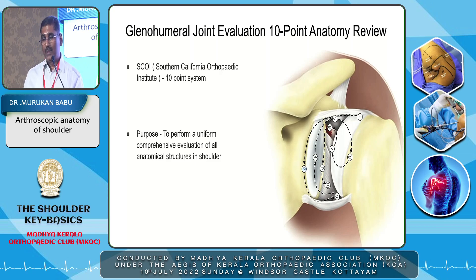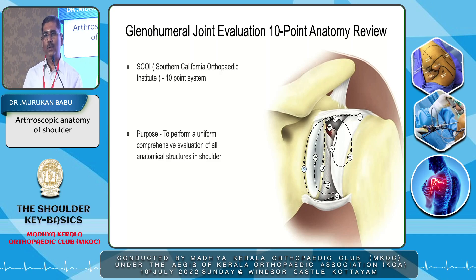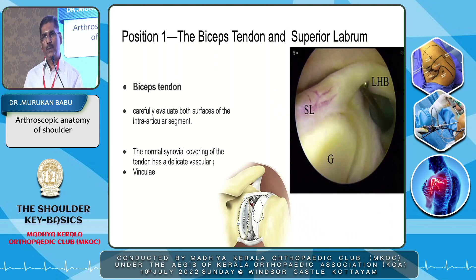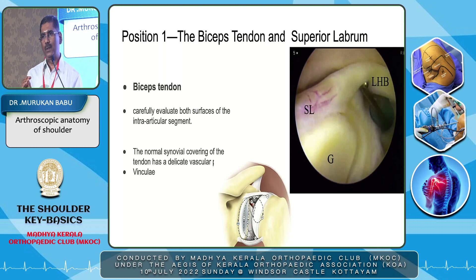In each position you are seeing certain anatomical structures in a different way. The purpose of this evaluation is to perform a uniform, comprehensive evaluation of all the anatomical structures in the shoulder. The first position is seeing the biceps tendon and the superior labrum. When you introduce the scope through the posterior portal, the first structure you see is the biceps tendon.